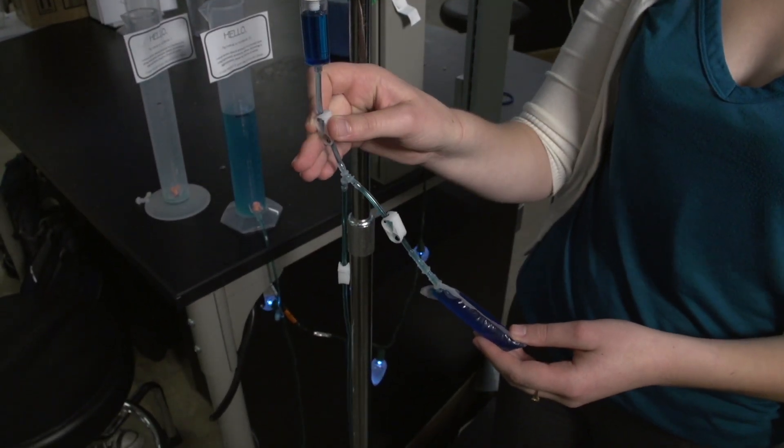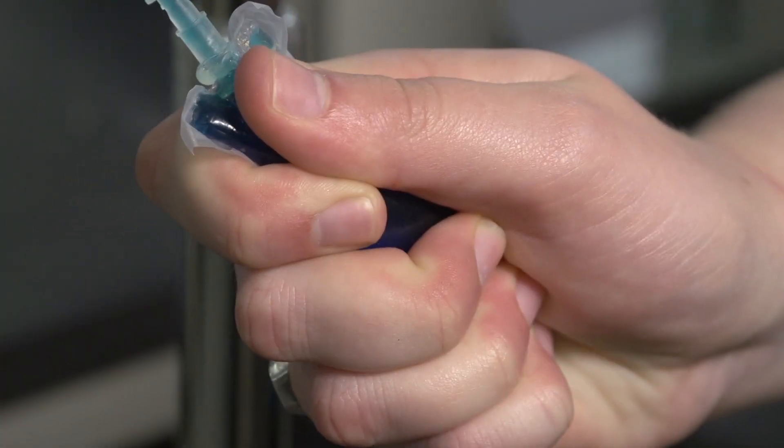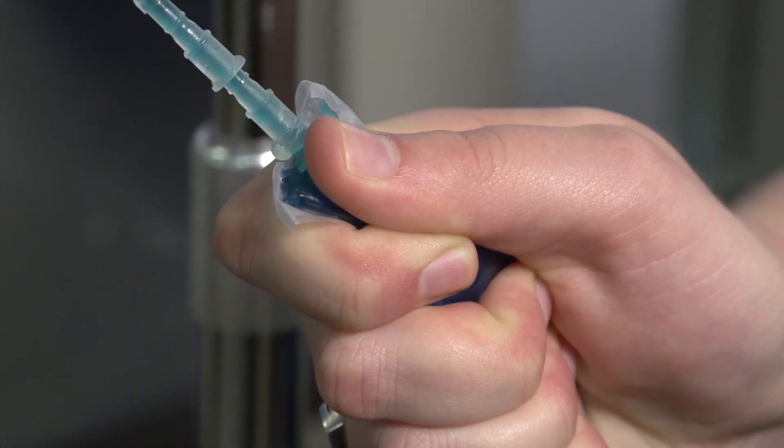After it's full, you close the top clamp, open the bottom one, and you can just squeeze the fluid through the IV tubing and into the patient.